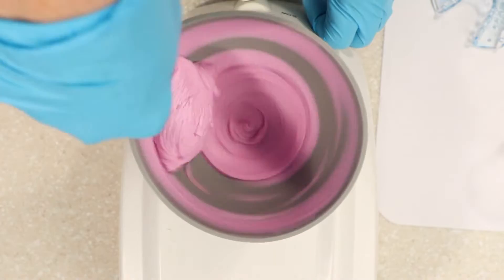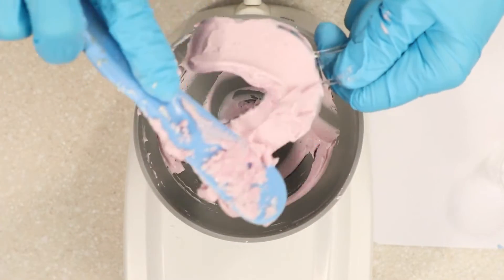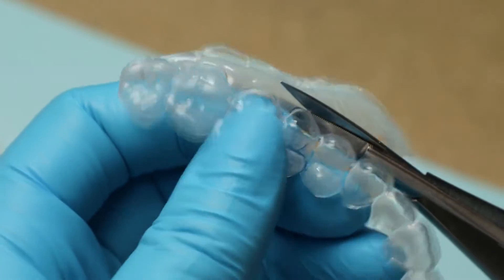Your dental office will create custom-made whitening trays for you by first making an impression of your teeth. Once the trays have been fabricated, you can begin treatment.